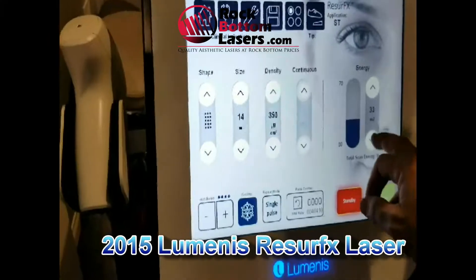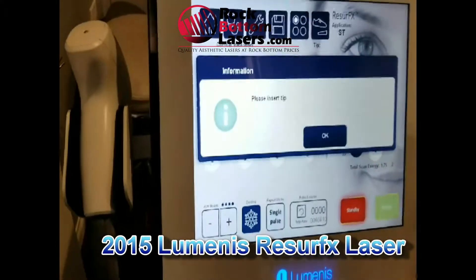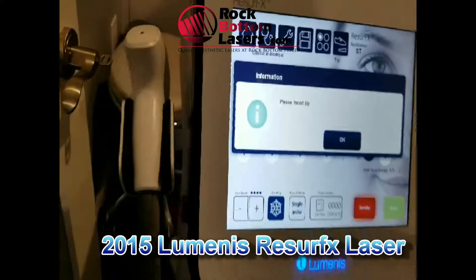I'm going to put it in. It says 'please insert a tip,' so there must be something.